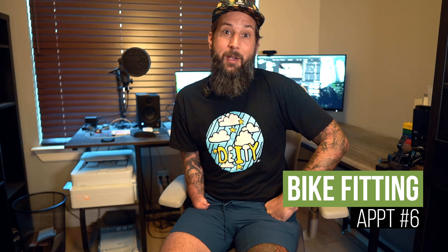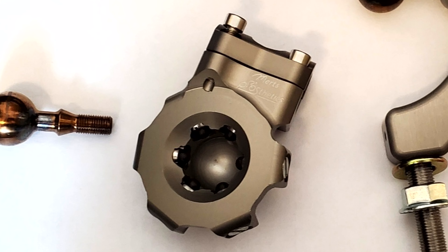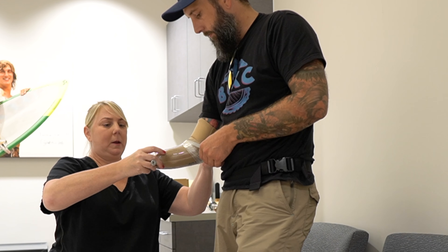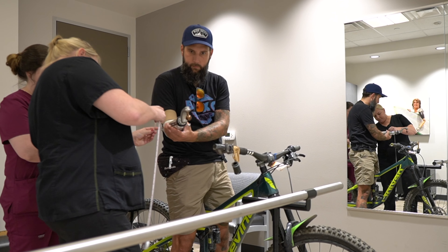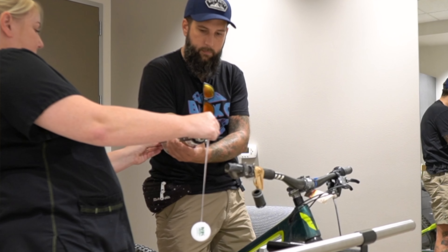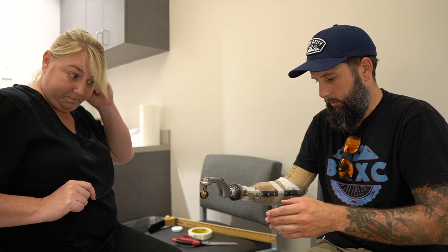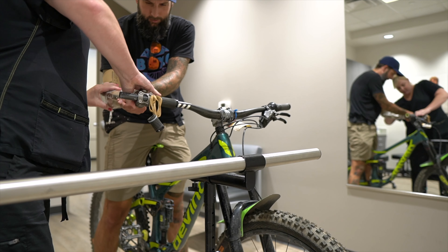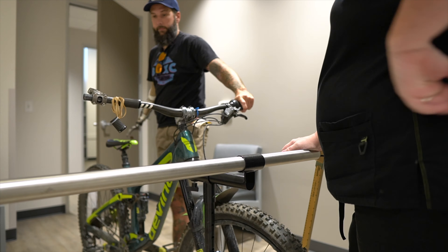Bike test appointment — time to bring my bike in. First we put the receiving cup on the bike; it looks like this. Next we put the liner and the second prototype on my arm. It now has a quick release button and a temporary wrist. Then the doctor measured my existing forearm and figured out how far off the end the actual wrist needs to be. She used tape to secure the frame to the prototype and then they pop riveted the frame to it. Next I sat over the bike and popped it in, made some more adjustments, put the seat up, and with a little track stand assistance I can tell that this is going to be amazing. Pop it out, but I have to be gentle so as not to break the prototype.